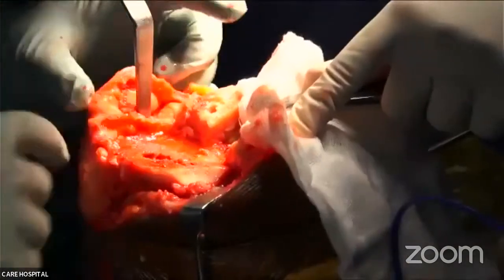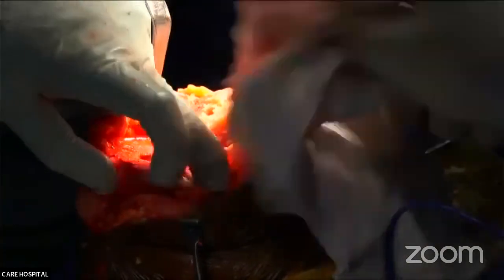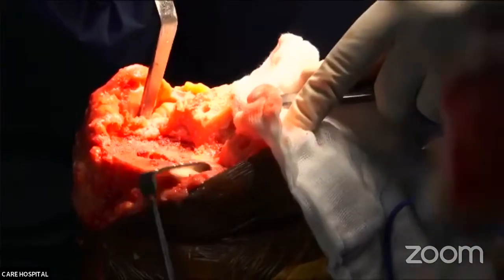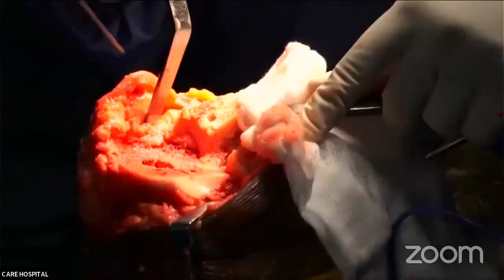Drill and screw. 2.5 drill bit for a 3.5 screw. Give the screw.